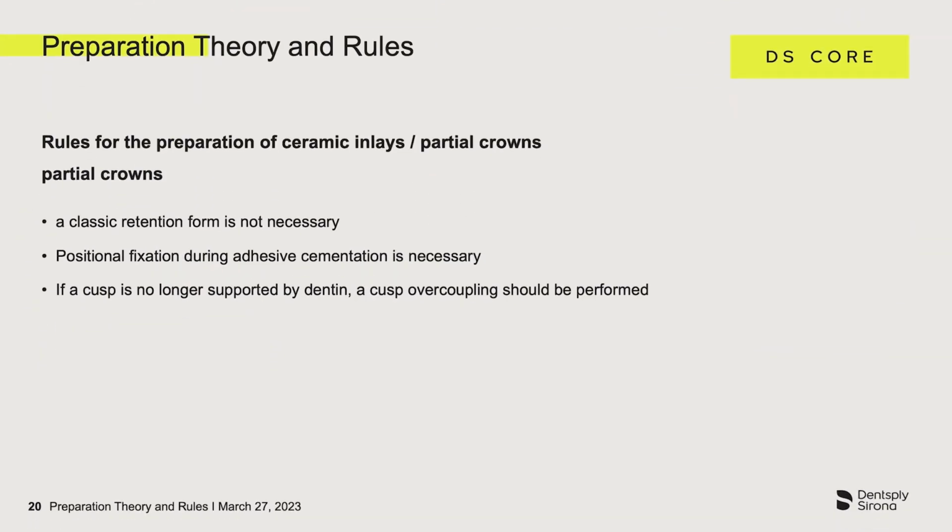When preparing partial crowns, no classic retention form is necessary. The only thing that is important is a clear positional fixation during the insertion. This is also referred to as a defined final position of the ceramic restoration.